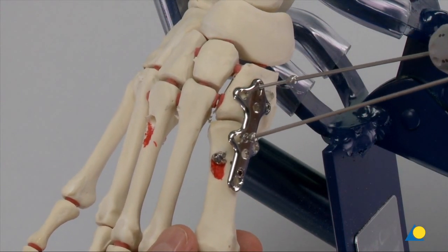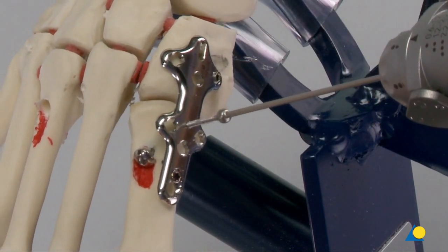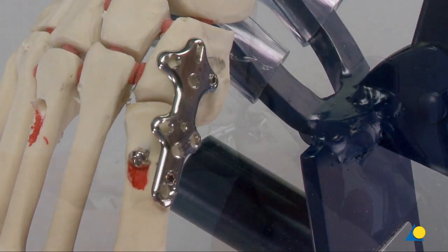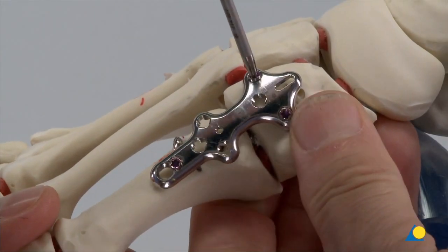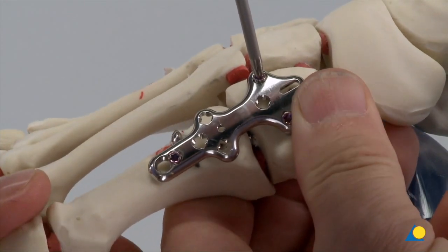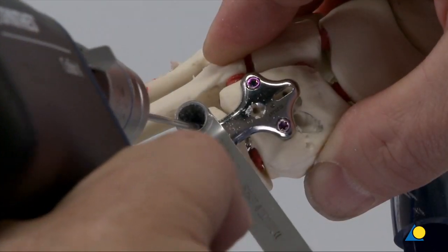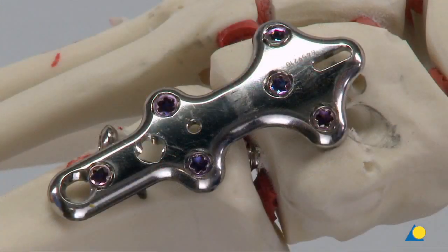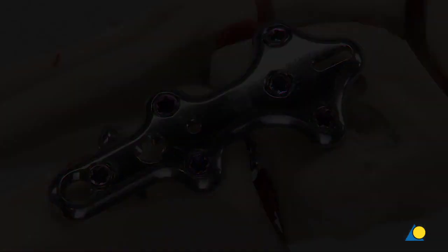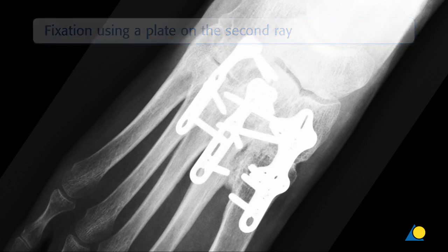The compression wires are removed. The remaining screw holes are drilled, measured and filled with 2.7 mm VA locking screws. The completed construct is shown. Clinically, it may be possible to use differing combinations of screws and plates.